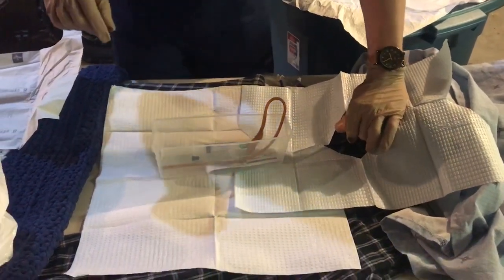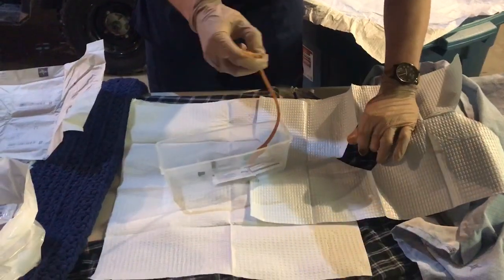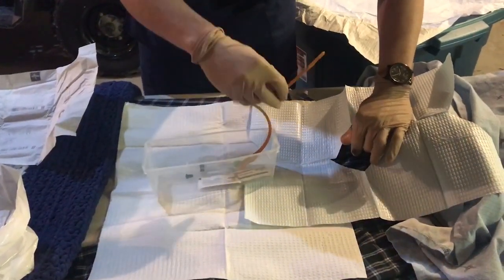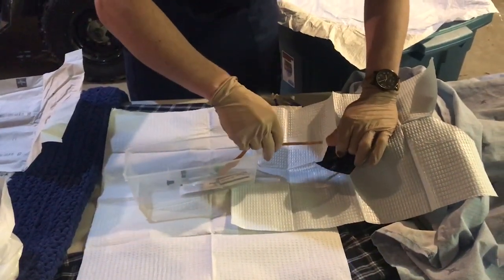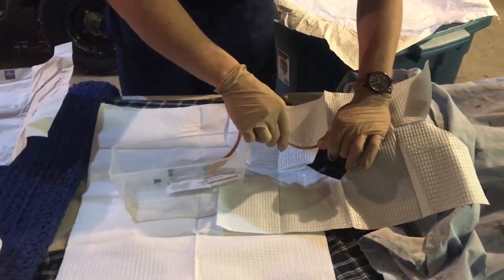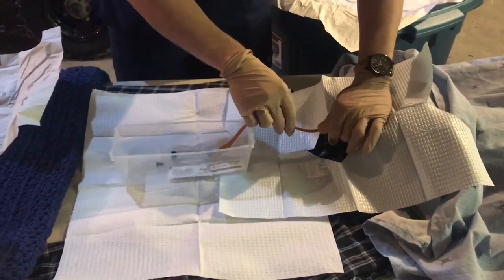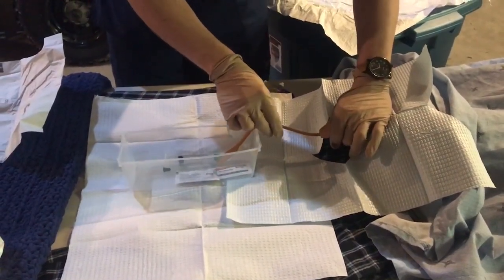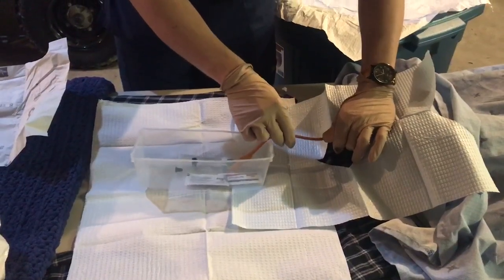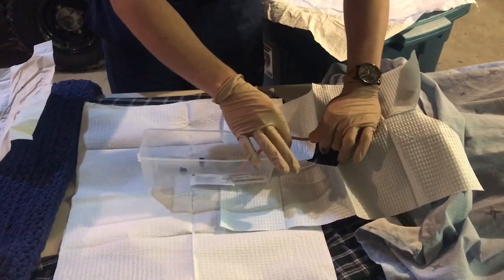Now that I've cleaned, I'm going to tell the patient that I'm going to be inserting the Foley now. I'm going to instruct them to bear down and take a few deep breaths. So here we go. Because he's male, I'm going to insert at 6 to 8 inches until I see urine. So I see urine now. I'm going to keep going another 1 to 2 inches to make sure that we are in fact out of the urethra in the bladder.